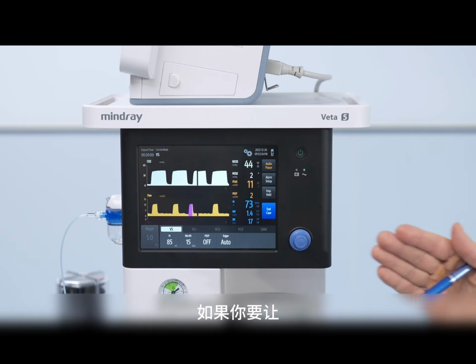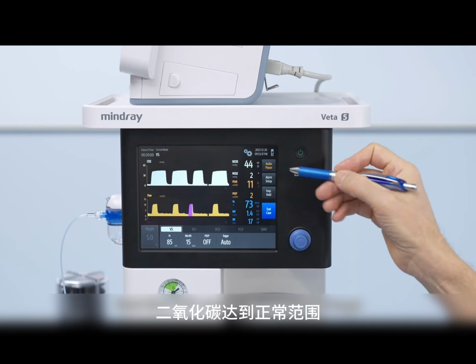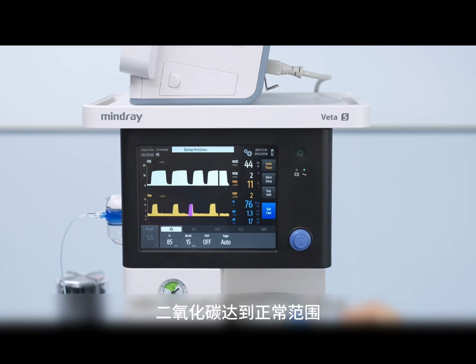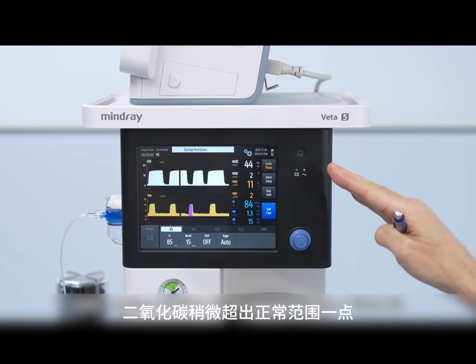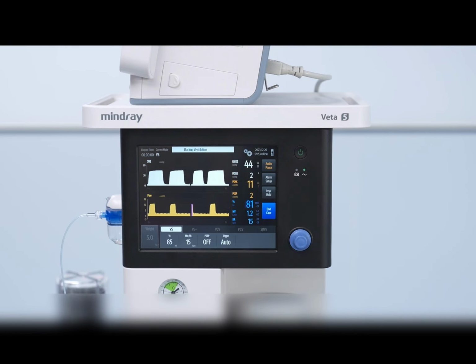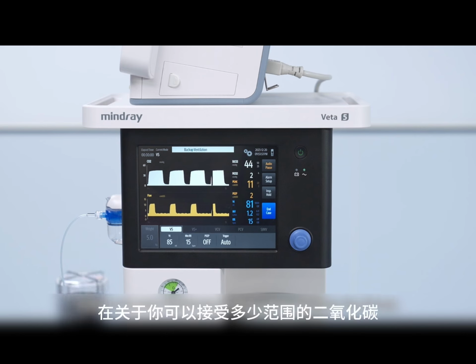If you could only achieve that the CO2 comes to a normal range with excessive ventilator settings, then I would be more willing to accept that the CO2 is going outside of the normal range a little bit. There are different guidelines of how much CO2 you can tolerate, and it's not written in stone.